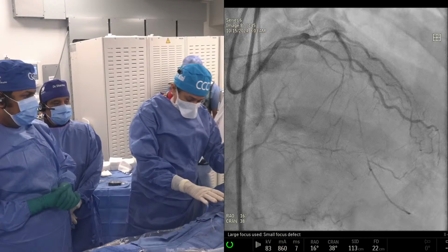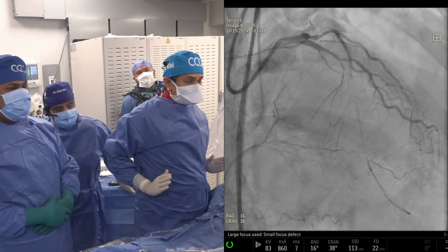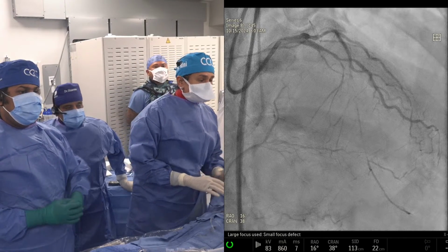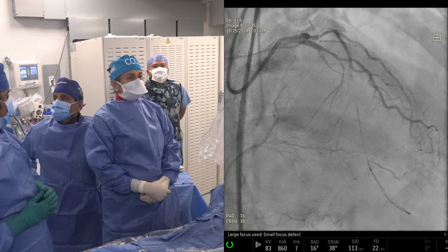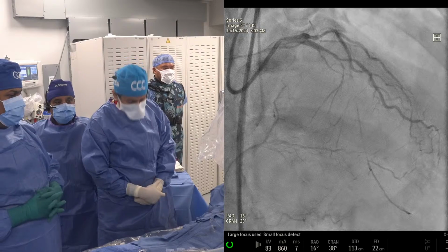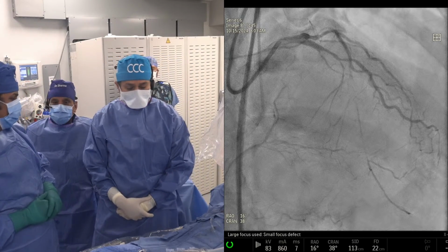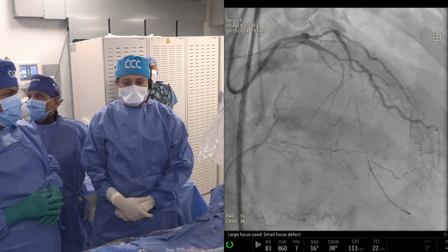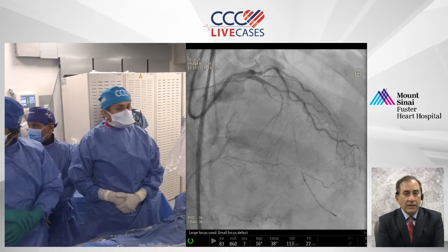So it's better you stay closer, comfortable, and stand straight, so you are able to do your procedure, rather than having your radial board and staying a little bit further away. If it takes a longer time, you will start having your upper back and lower back issues. L5S1. Yeah. Or then do the left radial. If you really want to do a radial and femoral, it should be left radial and right femoral. Yeah, but even then you will need a massage person to stretch your back. The strain is a lot.